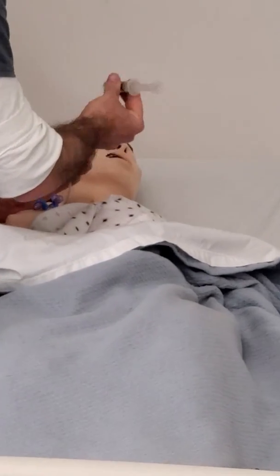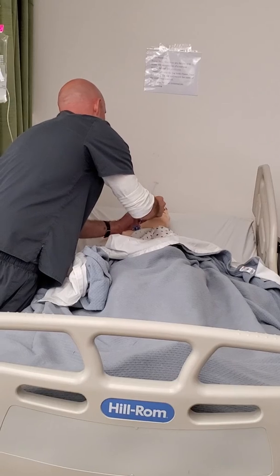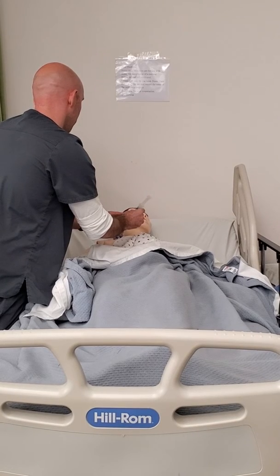Now, if that happened, if it touched anything, you'd be getting a new one and rewiping. Yeah, but nothing did. It's really dexterous. Alright, so now once I have that connected, I'm gonna open up the clamp.